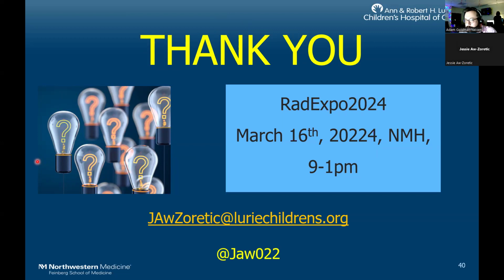How about you guys? What do you do? We started doing ASL in our neonatal protocols. We're trying to do it in more of the protocols as well, but it's definitely a work in progress to fine tune the imaging and make it useful, and also help with the prognostication.